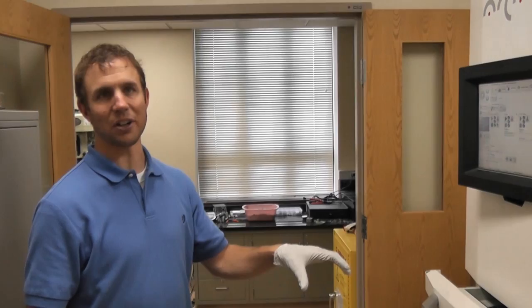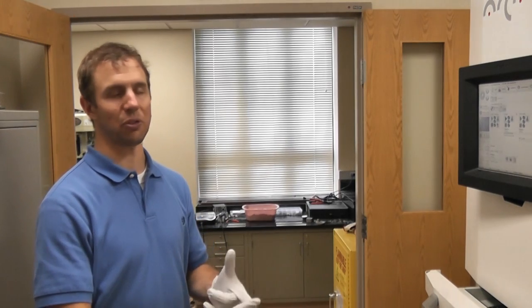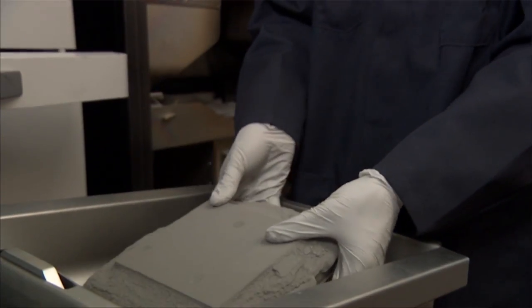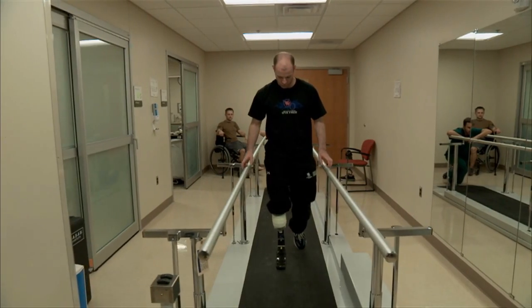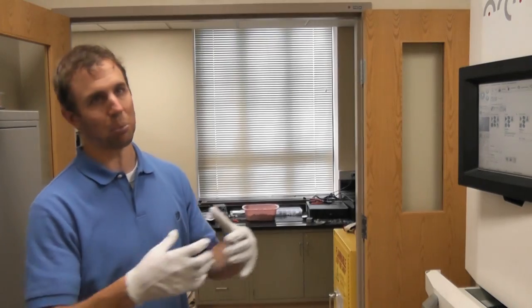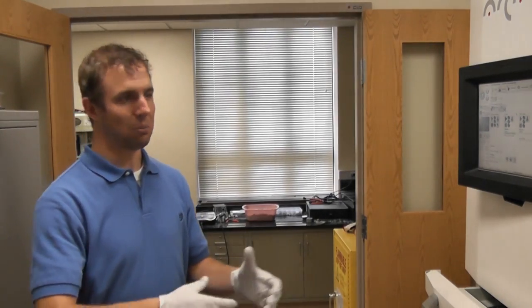We've had a lot of unusual stuff. We're working with the prosthetics lab downstairs — we've built attachments for patients to fire guns, fly an airplane, and we're trying to develop something for a guy to shoot a bow and arrow. There are a lot of unique attachments we're making: to play hockey, to go ice climbing, to go rock climbing. These guys think of it, we design it and print it out, they try it out, and we make modifications and print another one if needed.